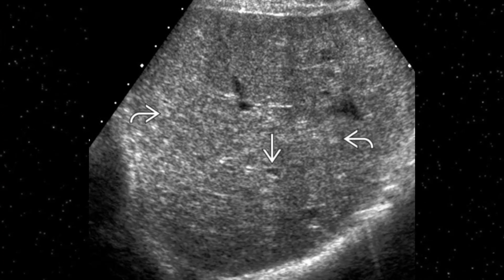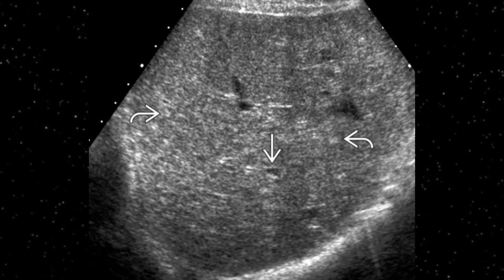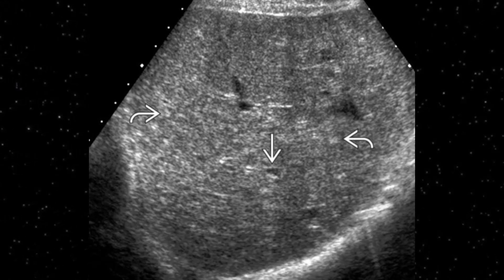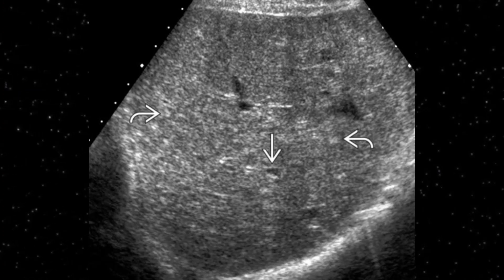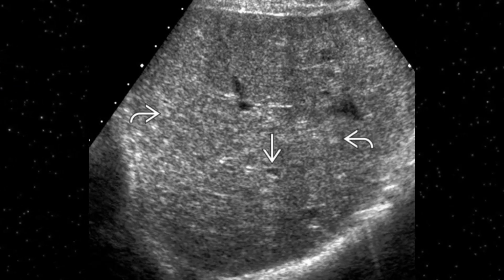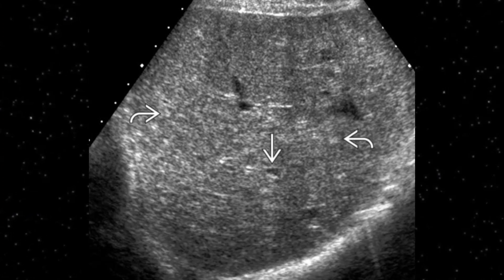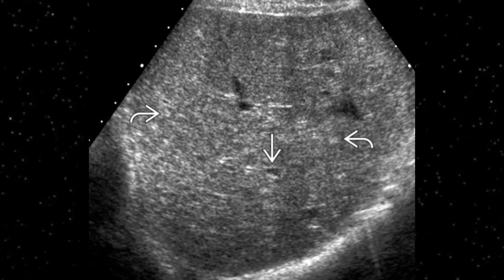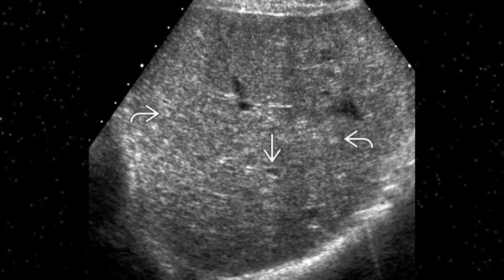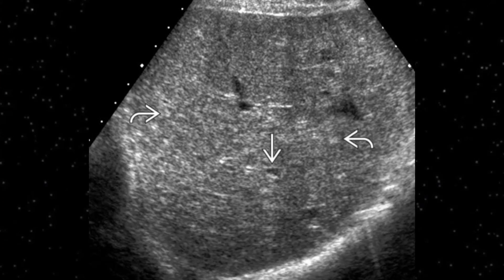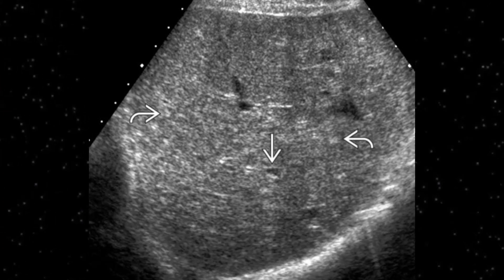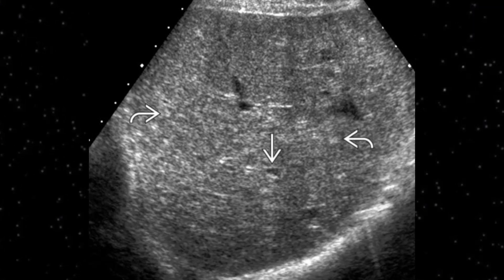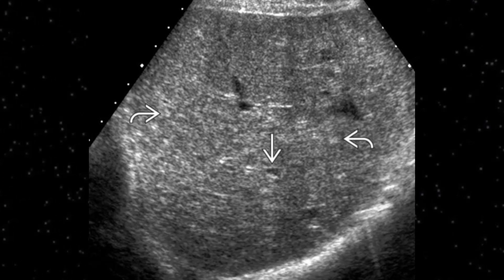This is an unusual and interesting slide — one can easily bypass these features as they are very small and tiny. Here, both components of biliary hamartoma are visible: solid echogenic nodules and small cystic lesions within the liver parenchyma. If you haven't seen these lesions before, or your ultrasound machine is not properly calibrated, you might think these are artifacts or overlook them entirely. Always focus carefully on the liver parenchyma for subtle findings.